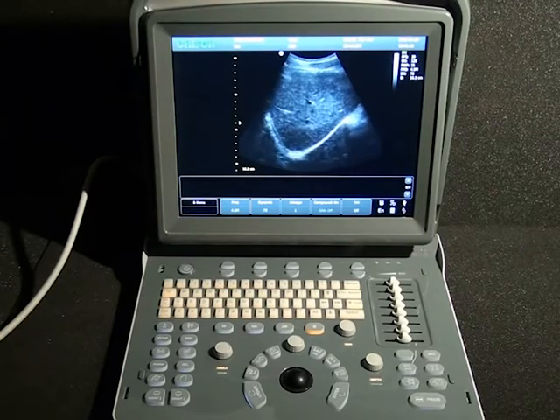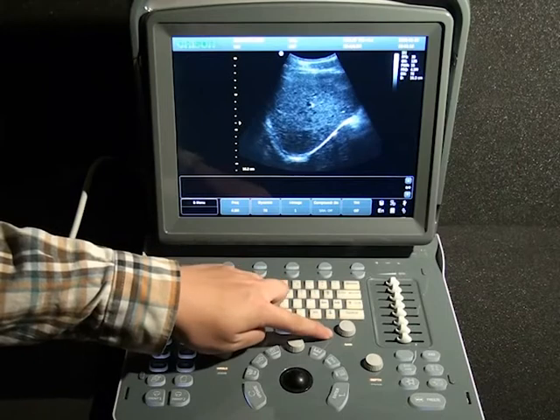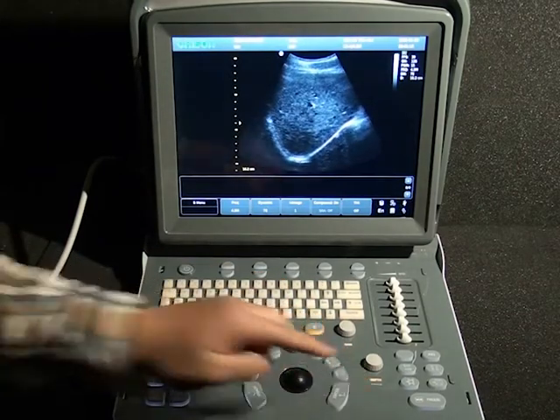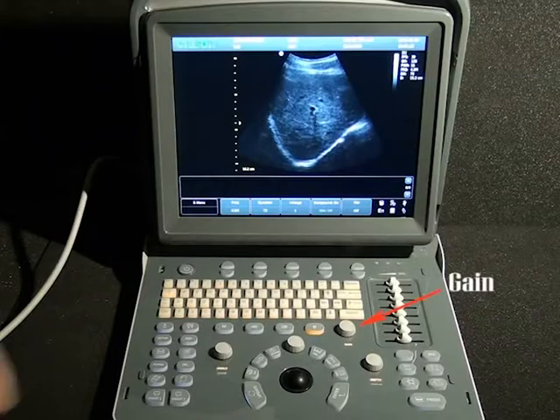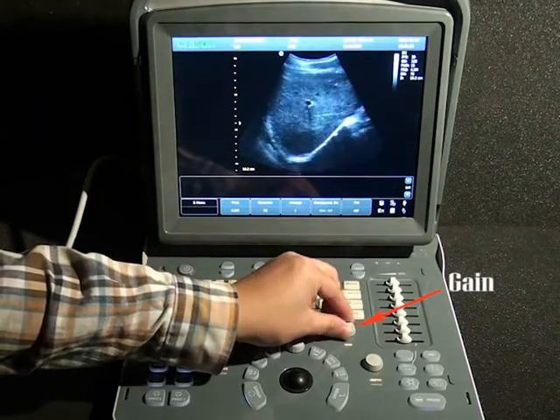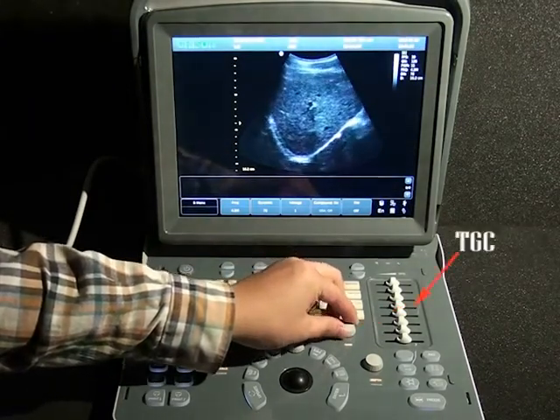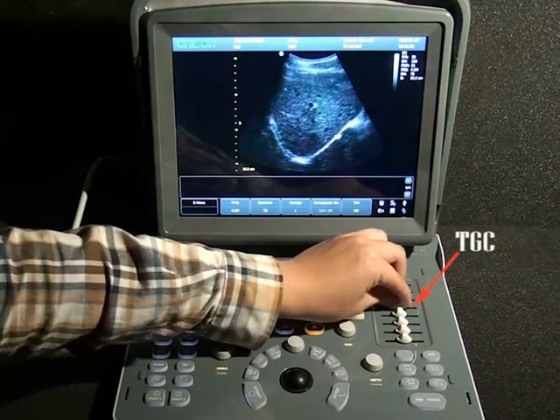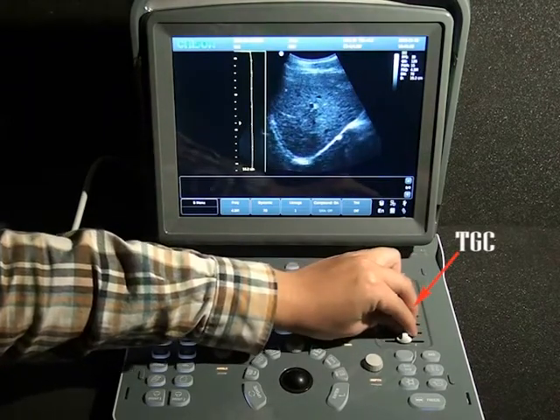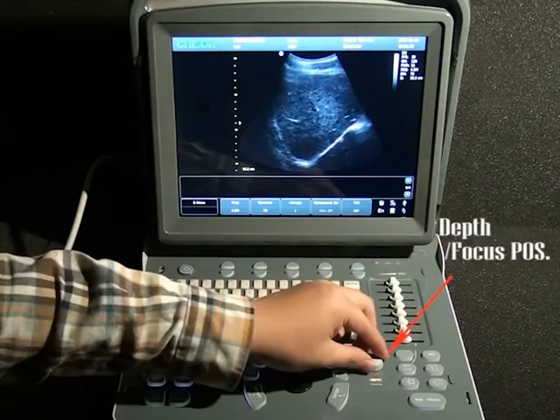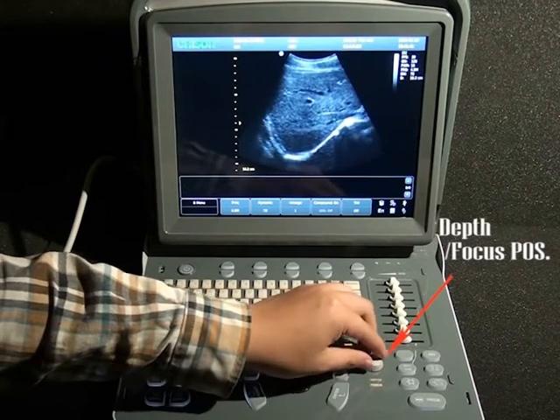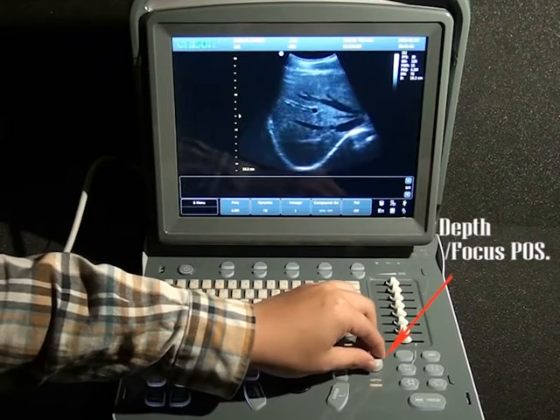In B-mode, we usually adjust the gain, depth, and focus position to change the image to a more suitable status. Twist the button to adjust the overall gain, while sliding the different segments of TGC changes the gain at different depths. Rotate this button to adjust the depth, and press it to switch to focus position adjustment.